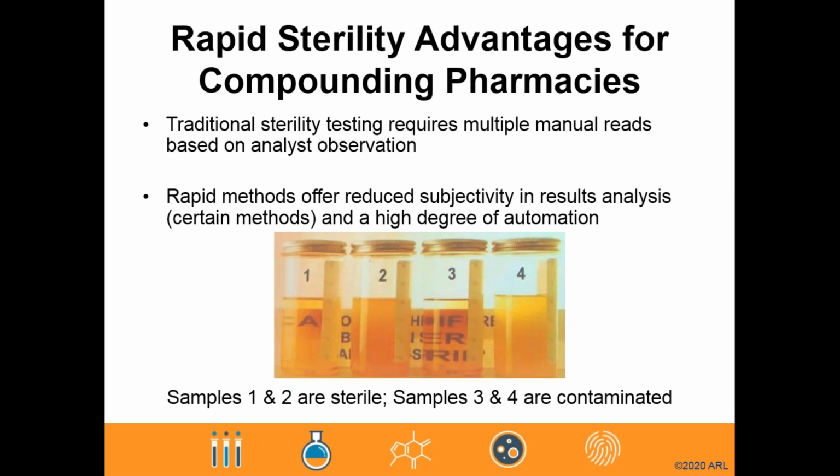With many of the technologies discussed in this presentation, the implementation of a rapid sterility method replaces the subjectivity of a traditional visual confirmation with an automated reagent-based assay controlled by an instrument. Results are controlled and reported through the software, avoiding transcription and interpretation errors potentially caused by an analyst recording or reporting handwritten results. Instrument usage logs can also be generated, which can help to meet audit trail requirements.